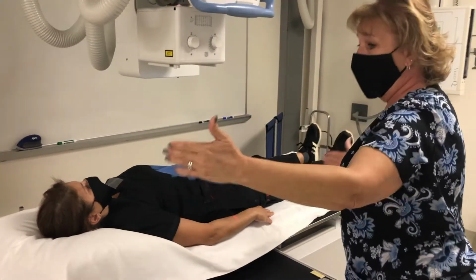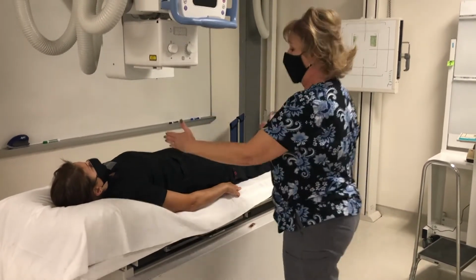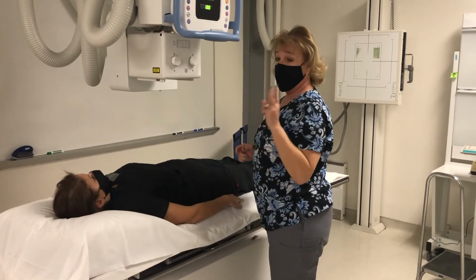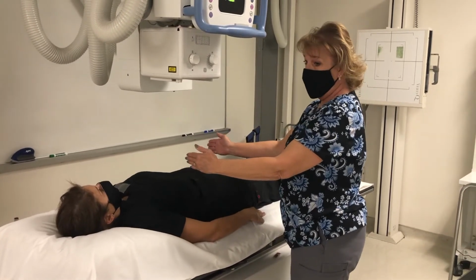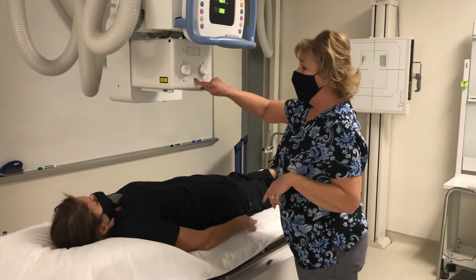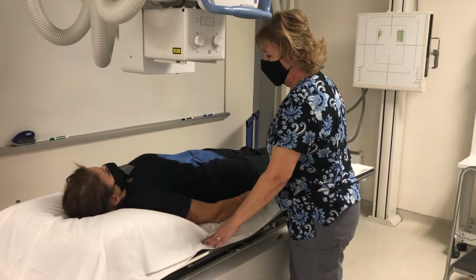If you have a really tall patient that isn't going to fit on a 14x17 image receptor, you may need to do two scout films, one that absolutely includes the kidneys, and then maybe come back and do a second bladder shot on a 10x12, because the radiologist needs to see the entire area prior to contrast injection.